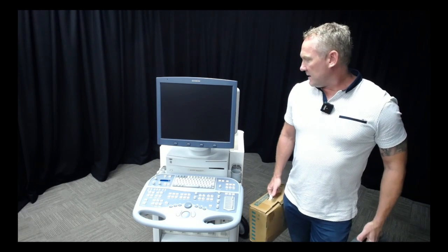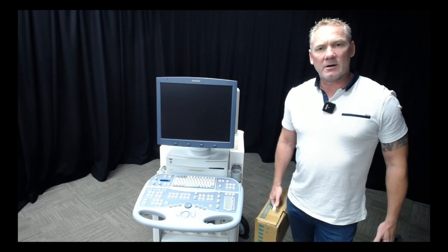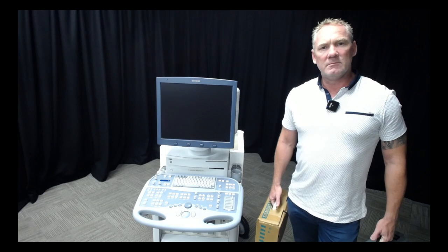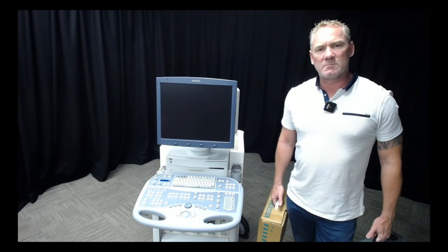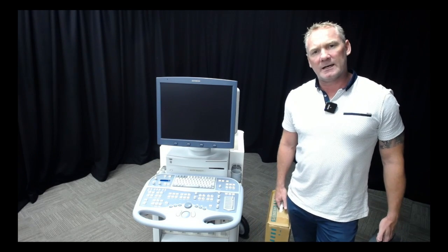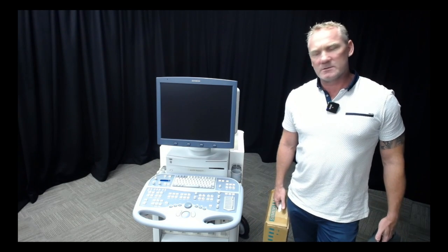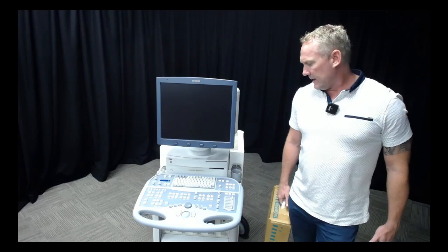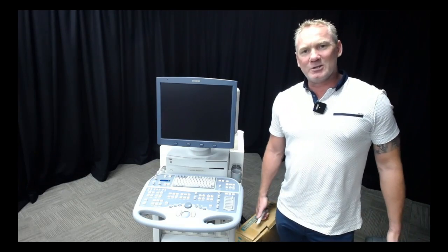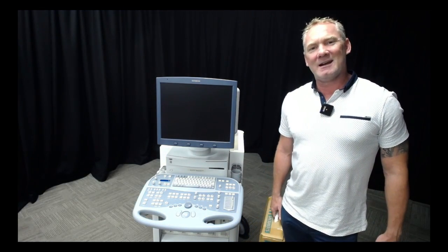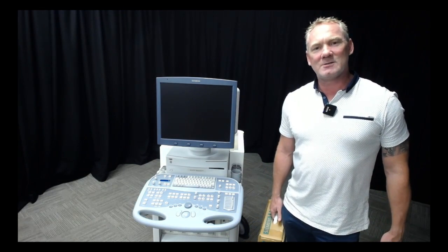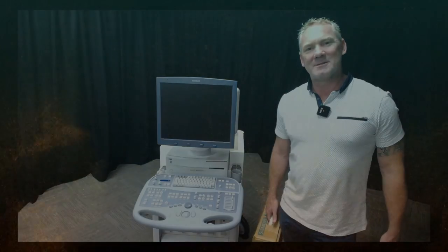If I can get some, I'm going to grab some Milton's spray and spray that on as well to really try and kill any germs that are on this machine. Just a really short video this week. Enjoy the week and we'll chat next week looking at the probes.